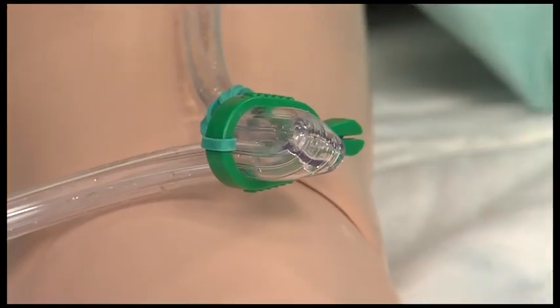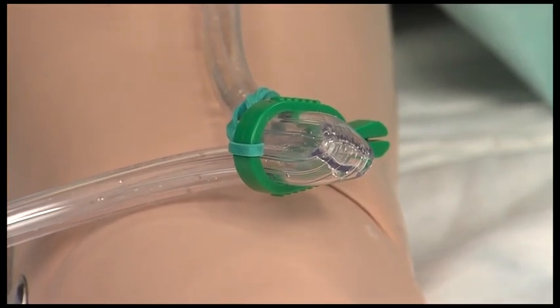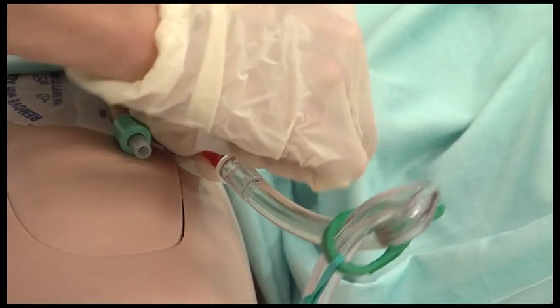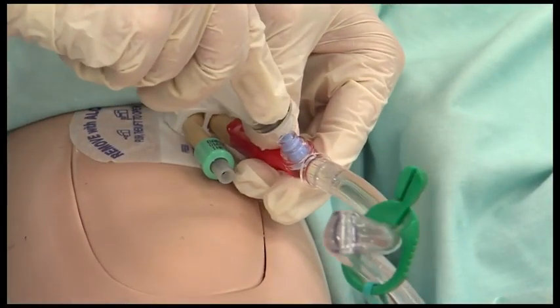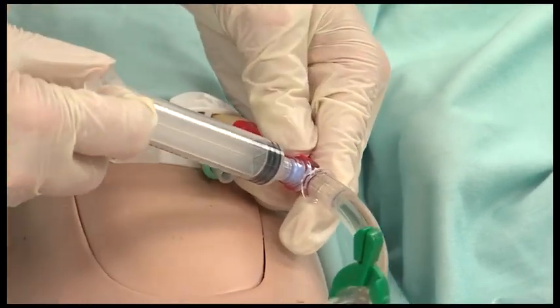If you need to obtain a urine sample, start by occluding the drainage tubing a minimum of 3 inches below the sample port. When urine is visible under the sample port, swab the surface of the barbed EasyLock sampling port with an antiseptic wipe. Follow the instructions of the antiseptic to ensure optimal result. Position the Luer device over the sample port. Press firmly and twist gently to open the port.